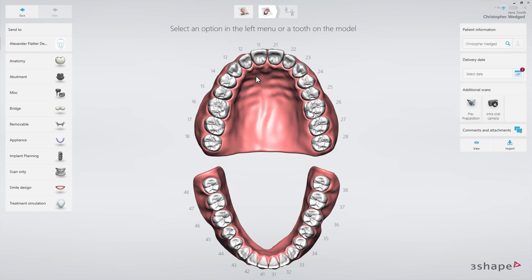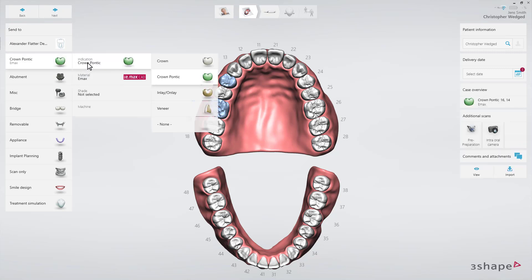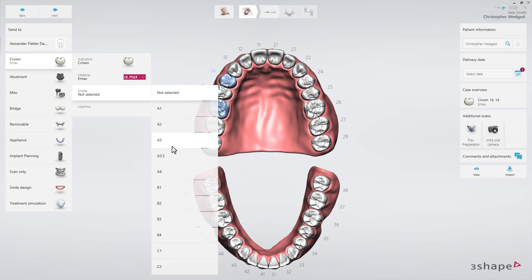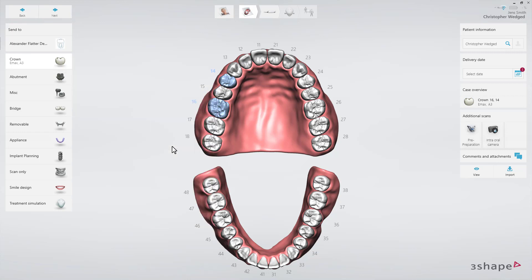First, mark the teeth that are going to be prepared. The teeth will be highlighted in blue. From the anatomy drop-down list, select crowns as the restorations. Then select the material in the material drop-down list. And if you have a pre-determined shade, select it in the shade drop-down list.